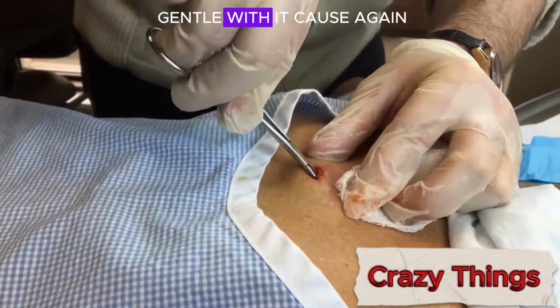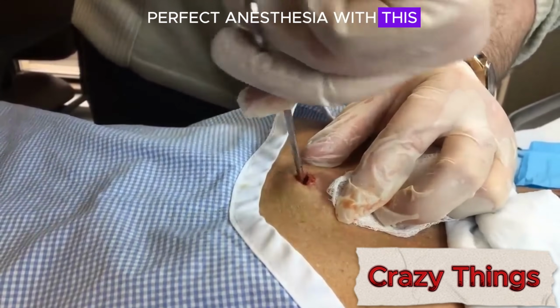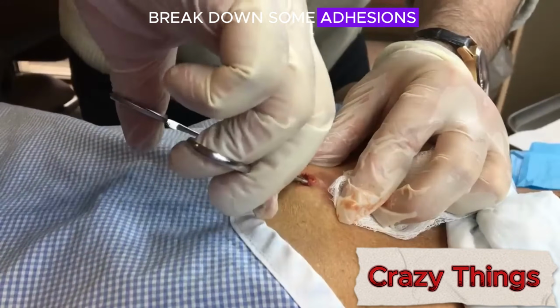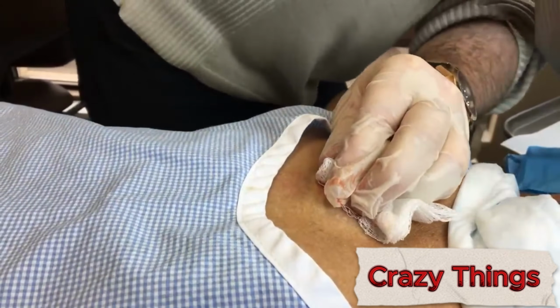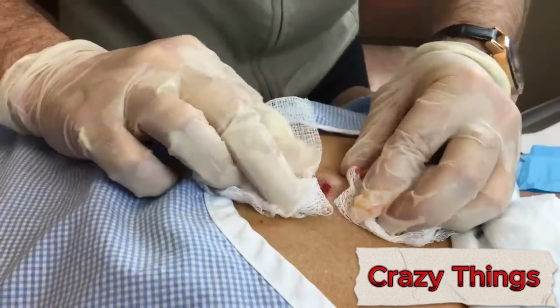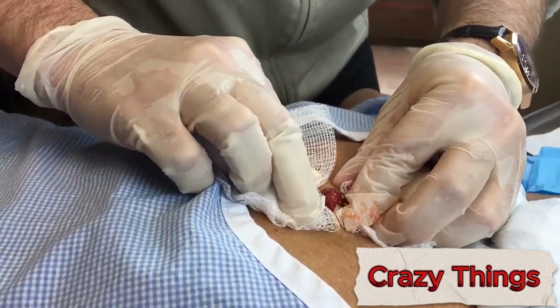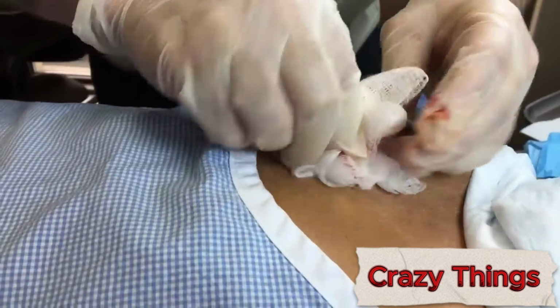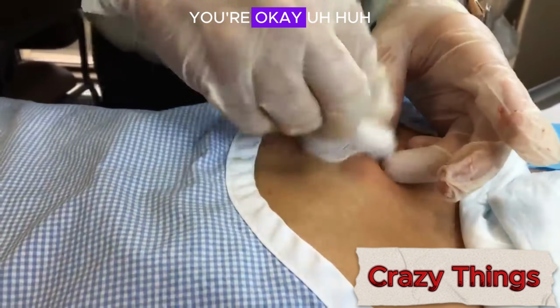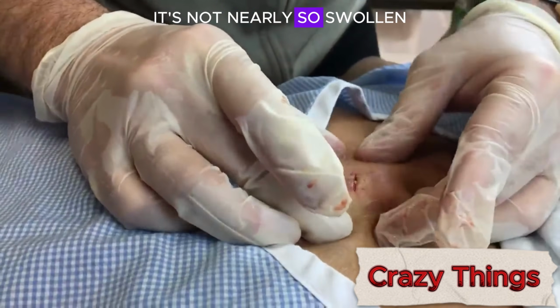But I want to be gentle with it because, again, remember, the patient can't have perfect anesthesia with this. So you certainly want to break down some adhesions, but there is a balance. You're okay? And you can see how the swelling's coming down already. It's not nearly so swollen.